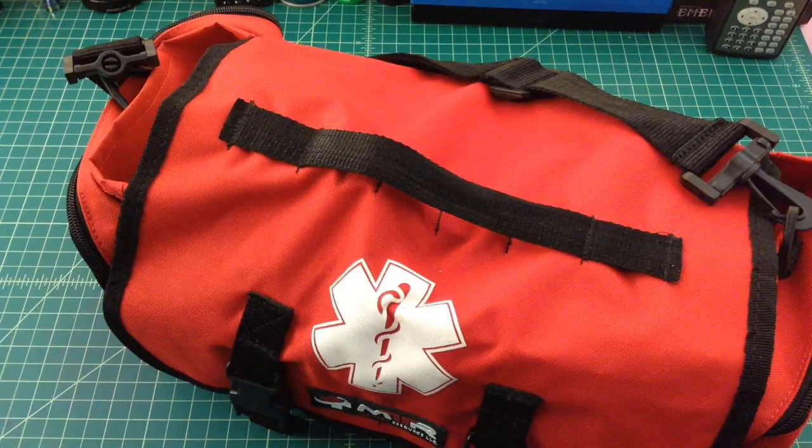I want to spend a few minutes going through my first aid kit that I keep in my car. This kit, the last time I checked it was about a year ago, and I've used it a number of times since then. We keep a first aid kit in each vehicle, a portable first aid kit like this in the house, and then some other medical supplies stored in a closet. What I want to do is just go through the car kit and see if you guys have any ideas, recommendations, or comments.